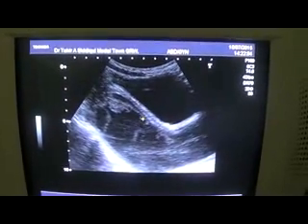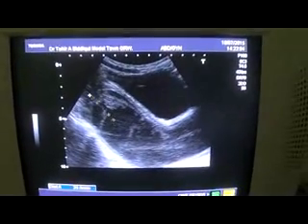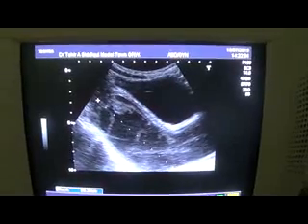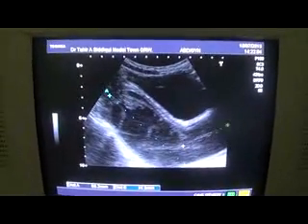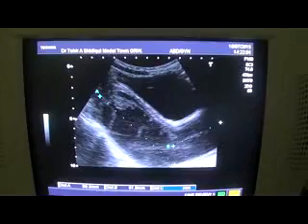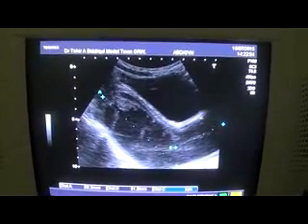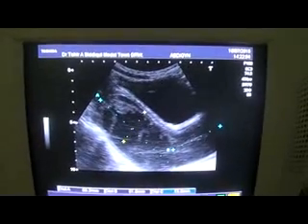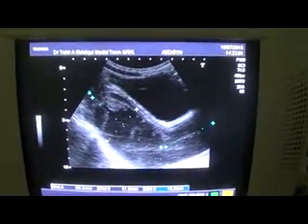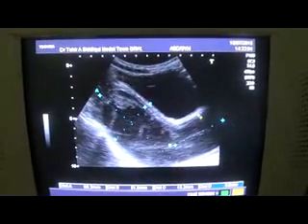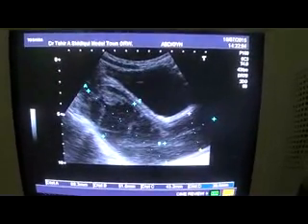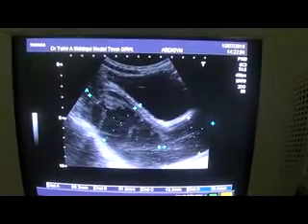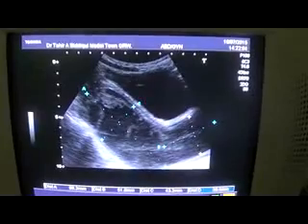This area is measuring 9.9 cm, and this region measuring 5.1 cm in length. This area measures 4.3 cm in anterior-posterior diameter, and this region measures 3.8 cm in anterior-posterior diameter. So this is the cervix and the vagina of this female child.